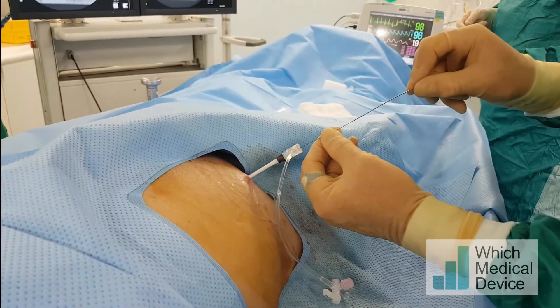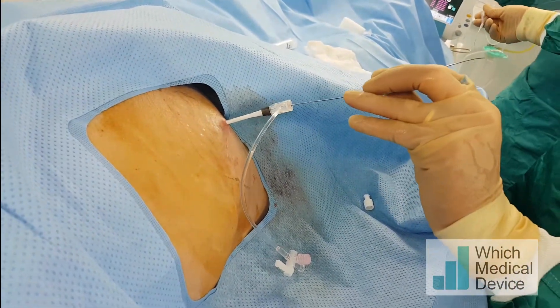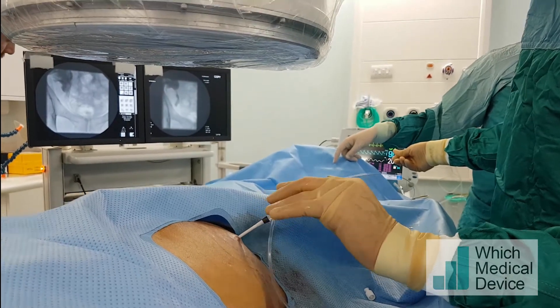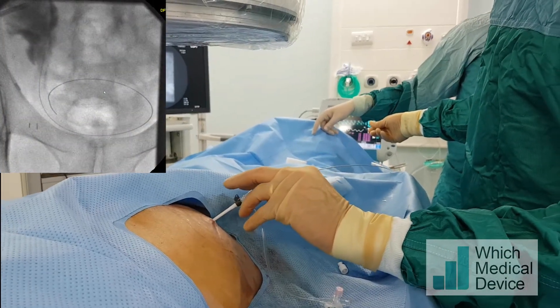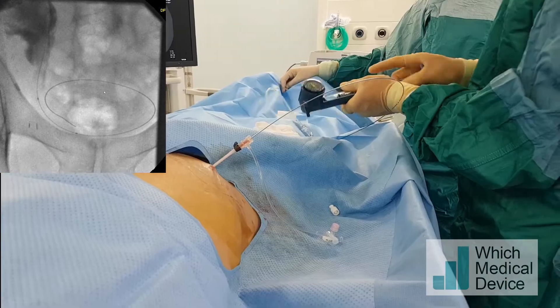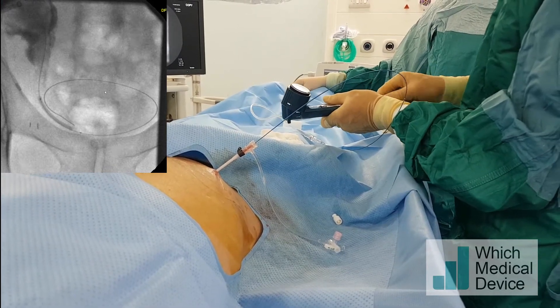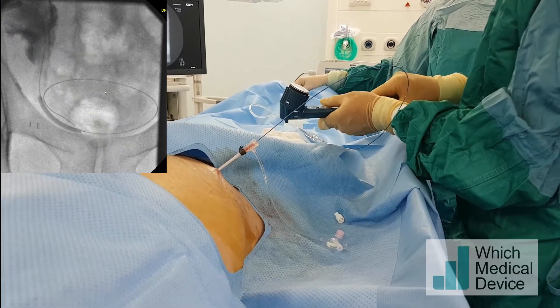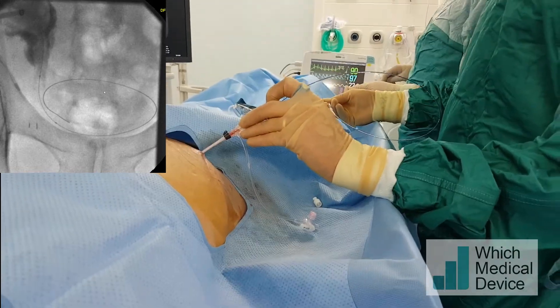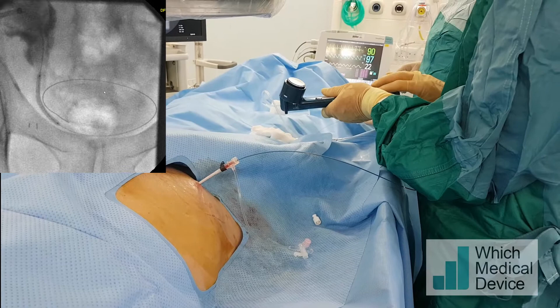We're now advancing a 3-millimeter by 4-centimeter balloon over the V18 018 guide wire through the sheath, and hopefully there will be enough support to get it down into the stricture. It's just going through the stricture and into the bladder — we'll start dilation from that position. There has been some extravasation of contrast, which I suspect leaked back around the sheath on the nephrostomy side. I'm pulling the angioplasty balloon back slightly and will redilate — you can see there's a little bit of waisting there.